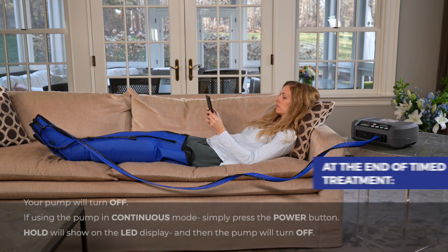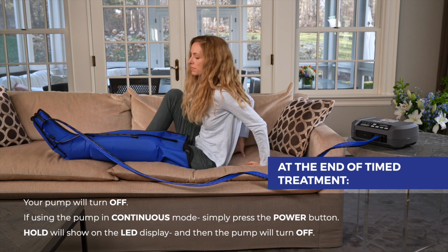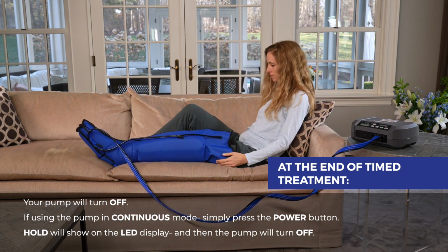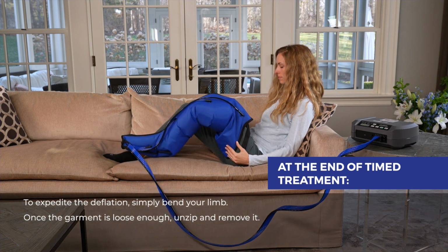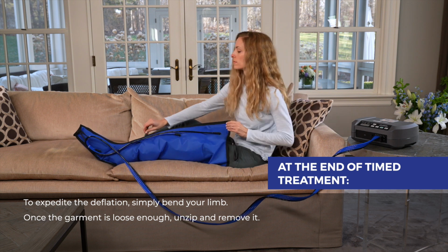At the end of a timed treatment, your pump will turn off. If using the pump in continuous mode, simply press the power button. Hold will show on the LED display, and then the pump will turn off. To expedite the deflation, simply bend your limb. Once the garment is loose enough, unzip and remove it.